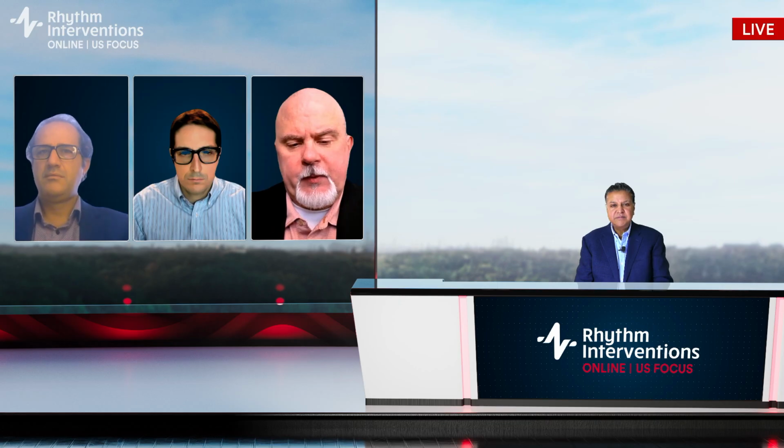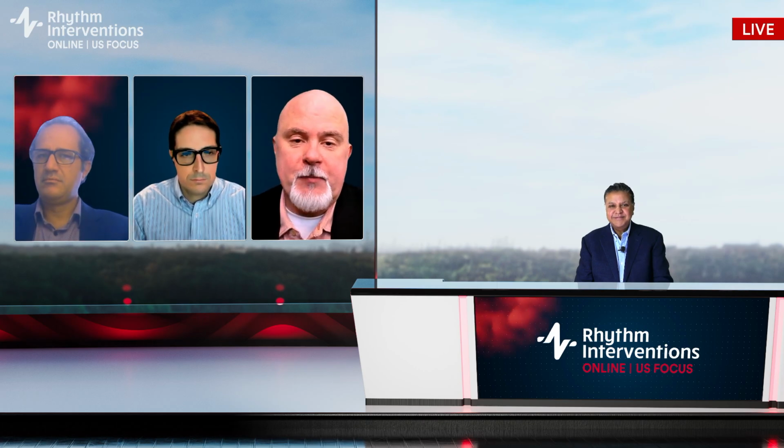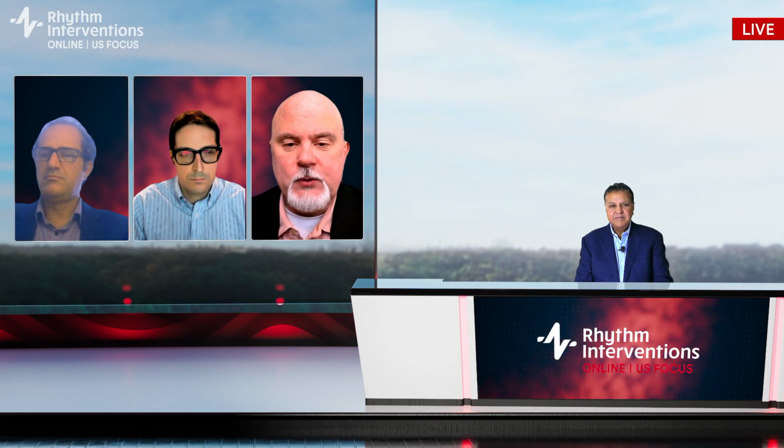Yeah, so when I agreed to give this talk, I wasn't given the topic yet until afterwards. I thought that was kind of funny because the new kid on the block is of course pulse field, and pulse field is sort of the exciting new toy, but it's also a very powerful toy. So having said that, though, there's still a role for radiofrequency. I don't think that we have to suddenly pretend that we didn't spend 25 years using it as the gold standard for managing rhythms. Moreover, I think that one of the advantages of PFA is that I describe it as a bit of a howitzer, if you're going to use a military term.